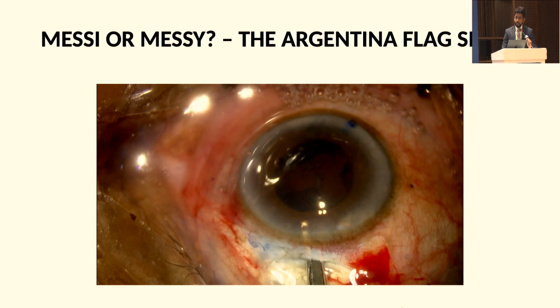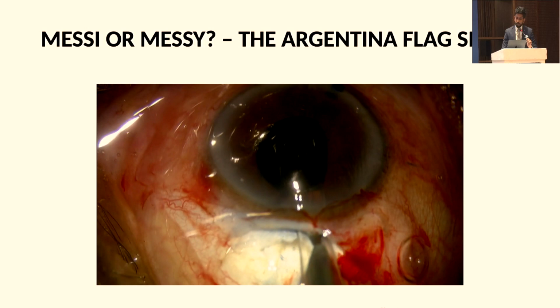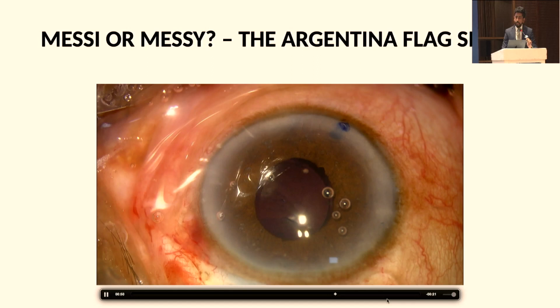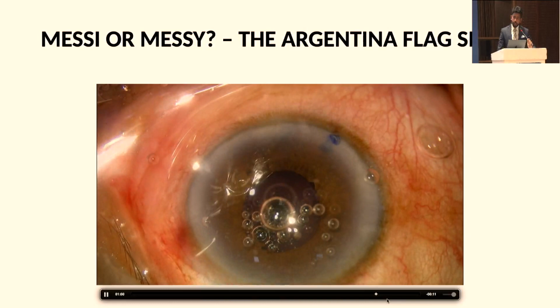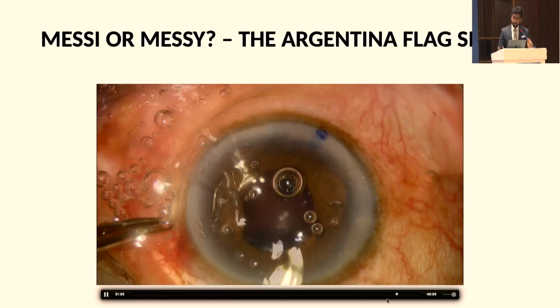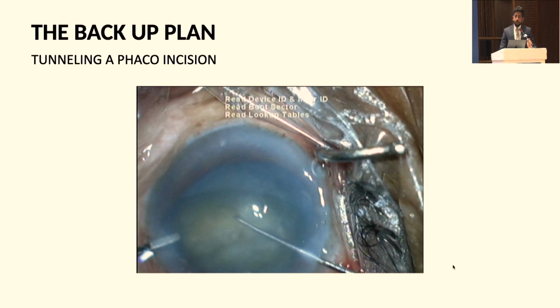After which you can just implant the IOL. After implanting the IOL, you can trim the anterior capsular rim. This will give the patient a good visual quality of life and avoid any form of anterior capsular phimosis or contracture syndrome. So always have a backup plan, like I said.